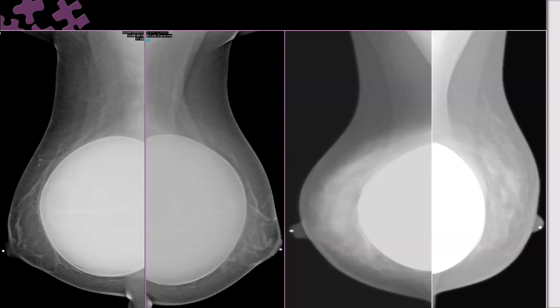No. I see the difference in terms of technique. I'm asking in this lecture about the technique. Here they are using the Eklund technique, in which they pull the breast. Yes, tell them what the Eklund technique is. They push the breast anteriorly, and the implant is displaced posteriorly. What is the other name for the Eklund technique?